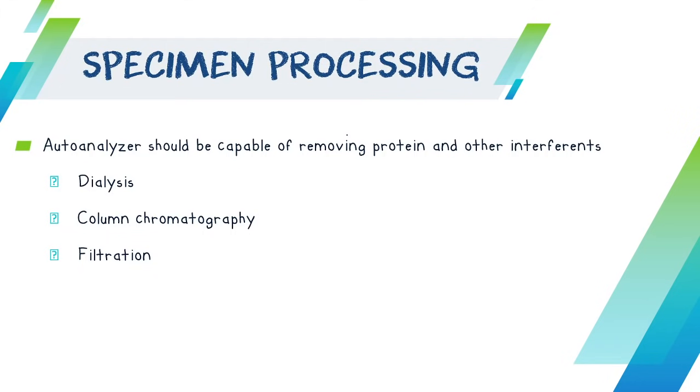And of course, as we all know, protein is already a big molecule. So that is why you really need to clean, and as much as possible, your auto-analyzer should have a certain process to remove proteins.